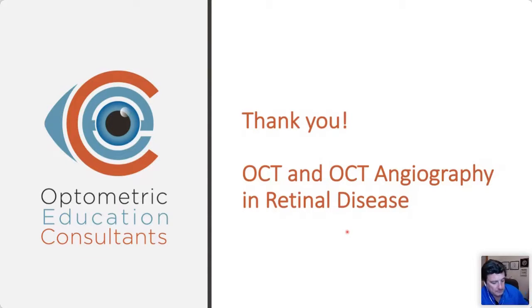Greg, we had a few questions, if you don't mind. Are you ready for it? In regards to your wellness program, do you have patients pay more for a macular OCT? I don't. With regard to the wellness program, we basically just offer two levels. It's Optos and just the regular B scan, and then we add a level of angiography. So most patients get what we call the triple O: the Optos, the OCT and OCT A. So we offer Optos and OCT B scan, and then they add in the angiography.